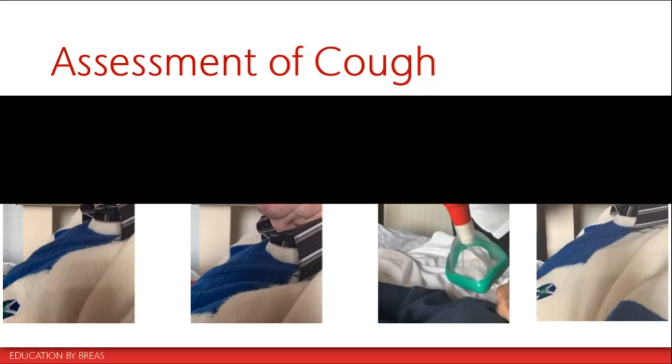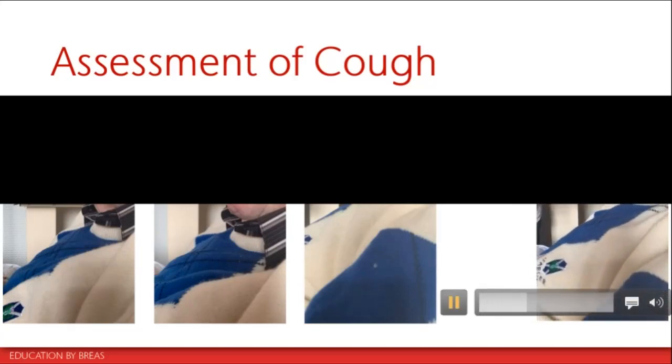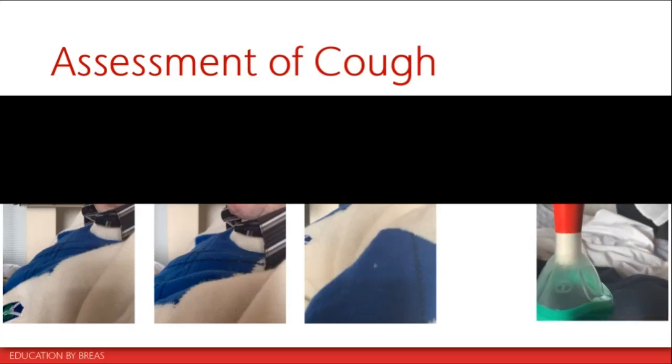The reason why I put this video in is that you find that patients, when they're performing an objective measure, when you want them to clear, when you want them to cough, they often find it difficult and will do an expiratory flow rather than a cough. And when you do get them to cough, perfect, you'll find that they can achieve it, and the cough peak flow was 150 litres per minute. So one thing to say is that no matter how much you measure someone's peak cough flow or cough peak flow, what you can find is that sometimes a spontaneous peak cough flow will always be greater than you trying to ask the patient to do it.